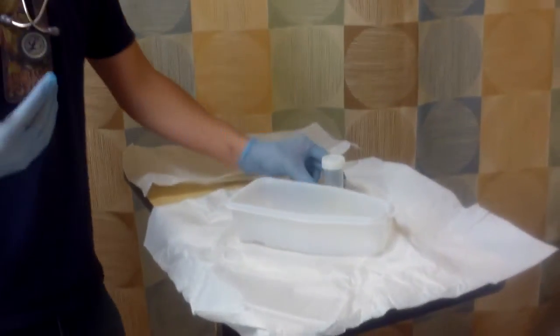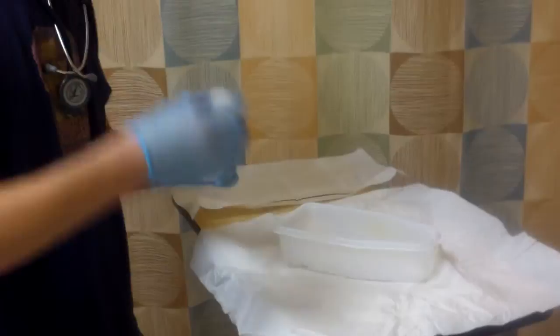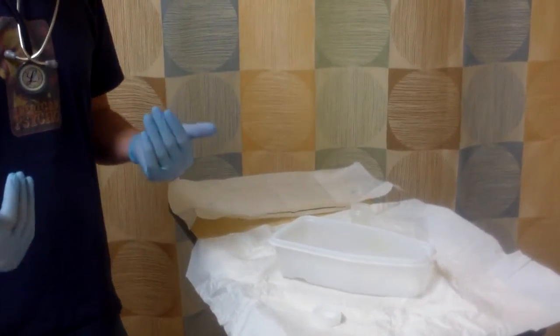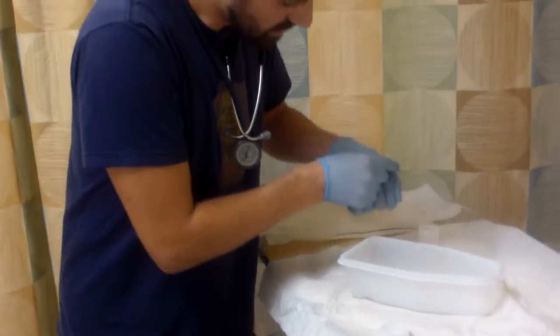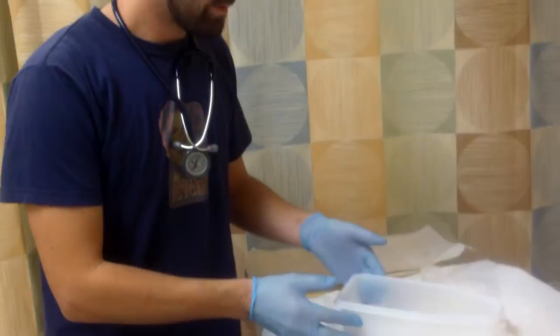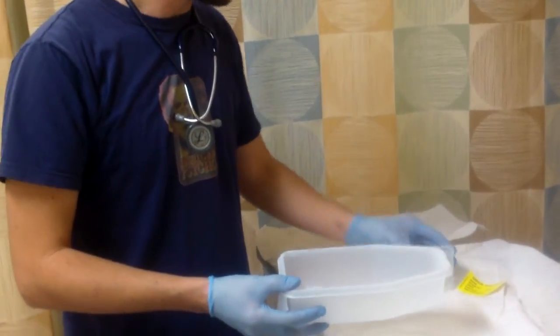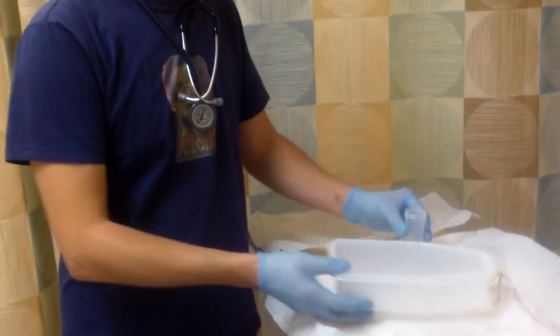And then for my urine specimen collection, I would open up my container. The inside has to remain sterile. So then I would open that up. For me, I would like a syringe. I would probably take a syringe and then aspirate some out and then insert it into the container. Or another option would be taking the basin over a toilet, not a urinal, or a basin of some sort, and then pour some in there.